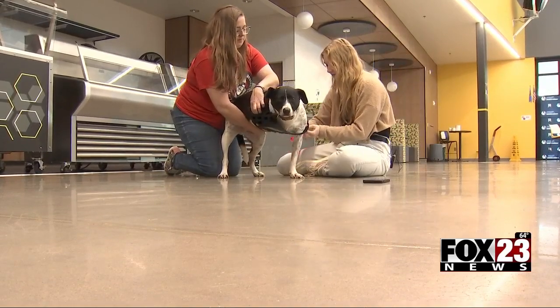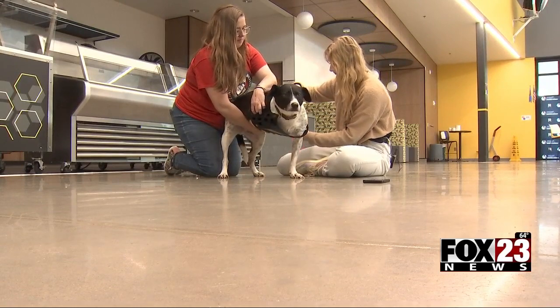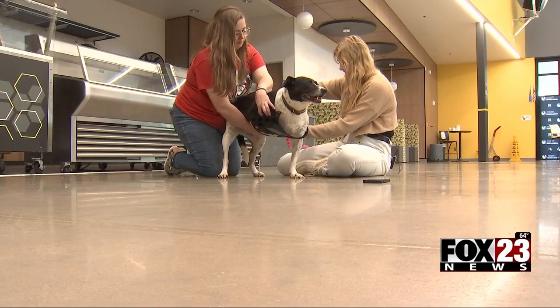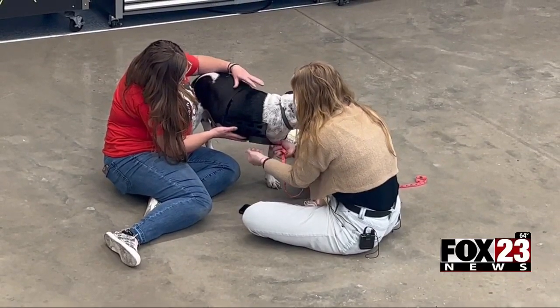Jamie Cope with BARC helped Cain recover from the leg amputation and find his forever home. Now Cain gets around as well as any other dog, but running on only three legs takes a lot of energy. Brooke hopes the new leg allows him to get around with less effort. She says, 'I feel like there's a lot of people out there that we can help and we don't really realize it.'